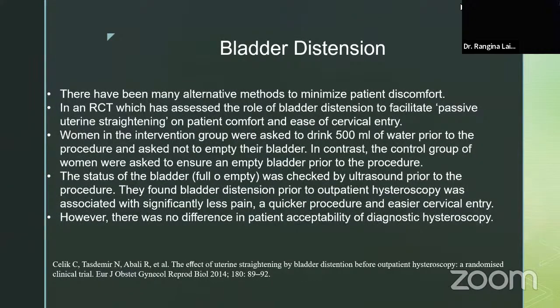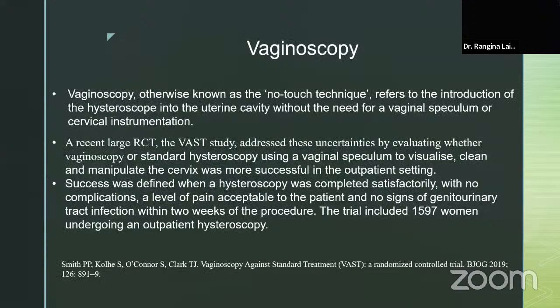And these are some of the studies about bladder distension. They say that in order to minimize the patient's discomfort, we can ask the patient to drink around 500 ml and then distend the bladder. Yes, this is what we have.